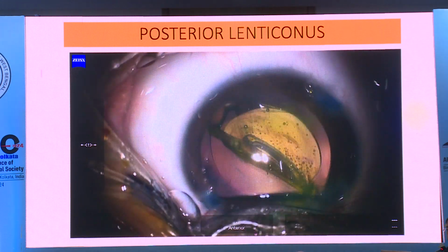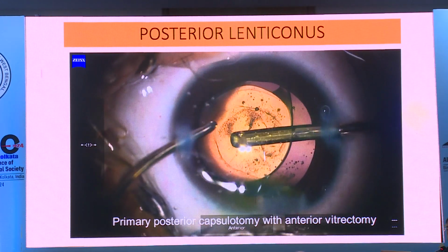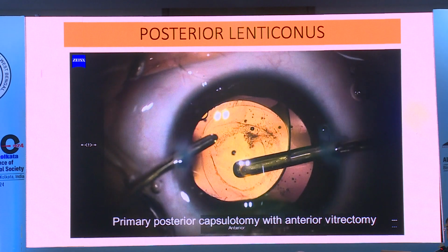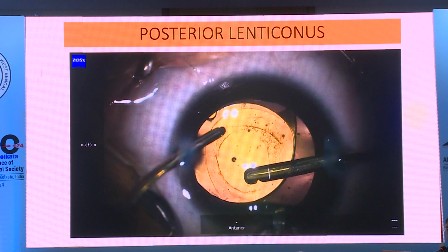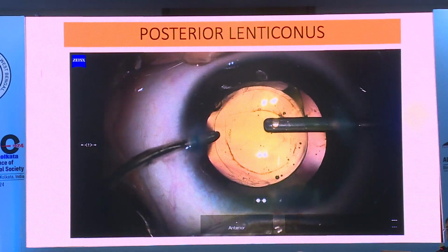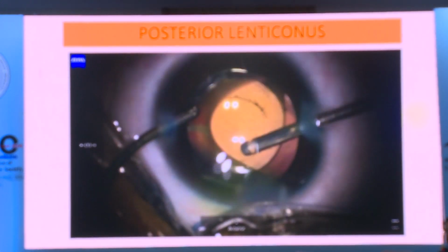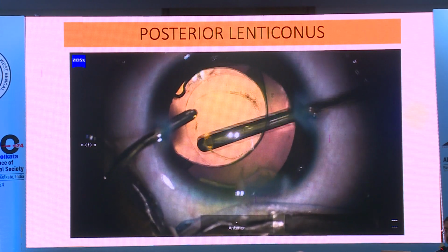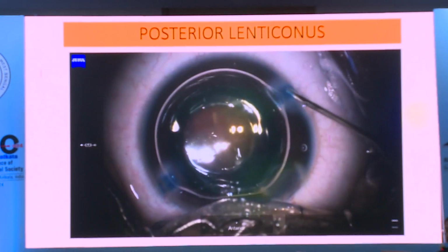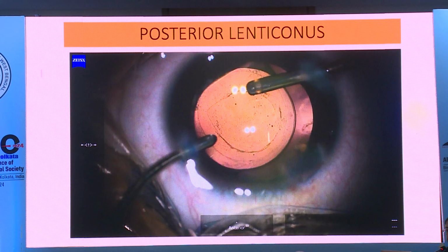of the IOL, that is a hydrophobic acrylic IOL, in the capsular bag. After implanting the IOL in the bag, an appropriate size posterior capsulotomy was done, and this has ensured the implantation of the IOL in the bag. And this triamcinolone helps to detect any traction, vitreous traction. In smaller children, we place a suture, particularly on the main incision.